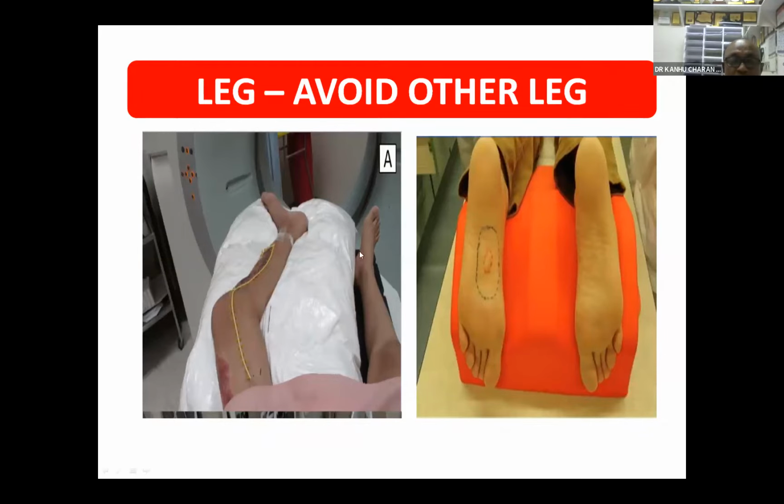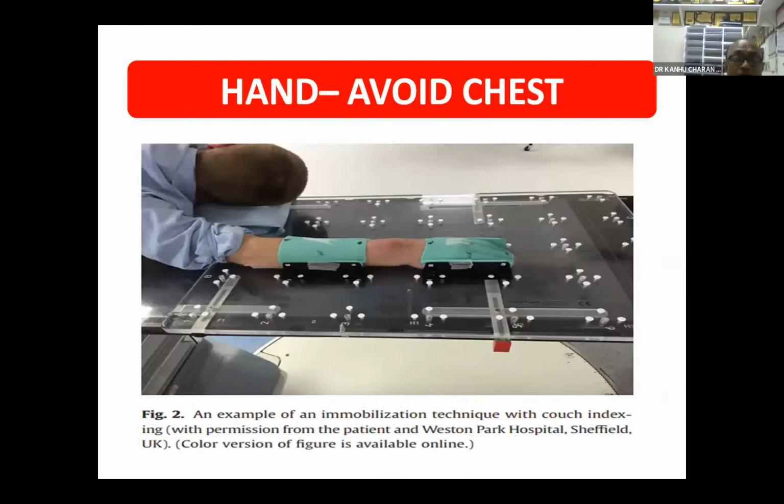Similarly, you can use foot rests. It will help you to position the legs. There are knee rests, foot rests, leg rests, and lots of immobilization devices available that you can utilize. And avoid the chest.